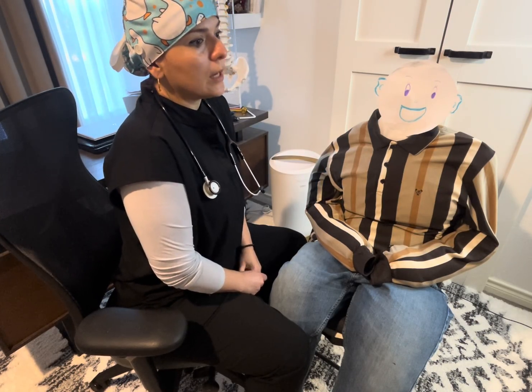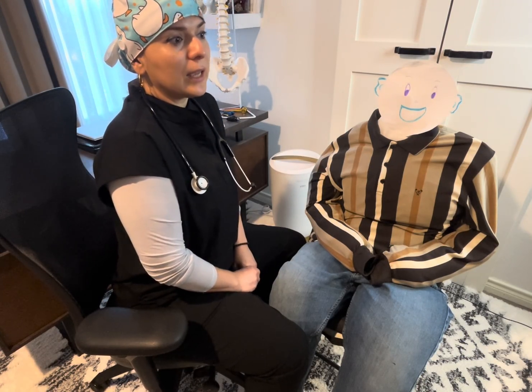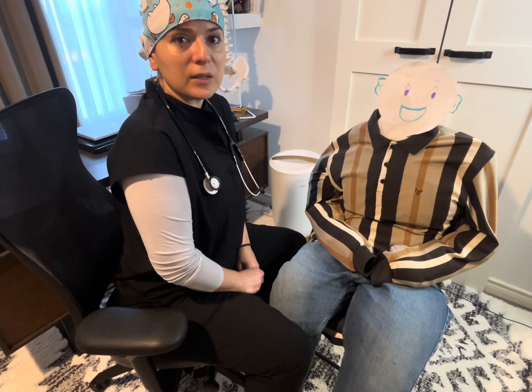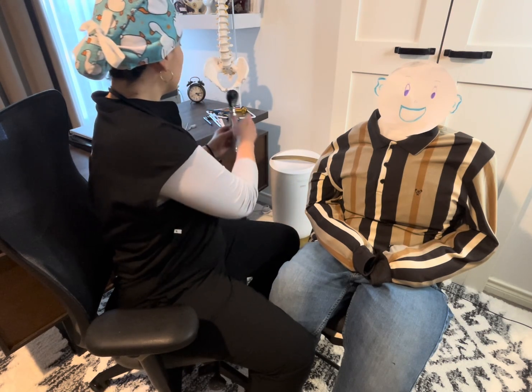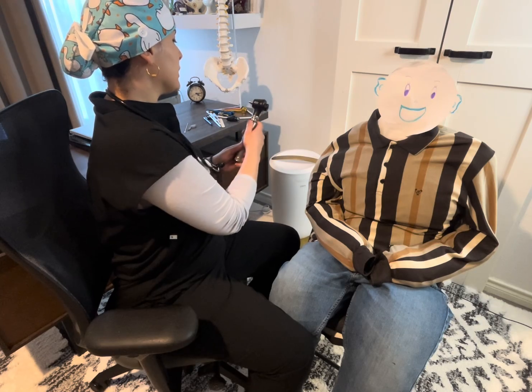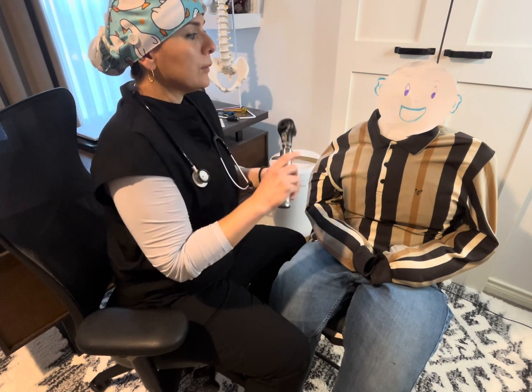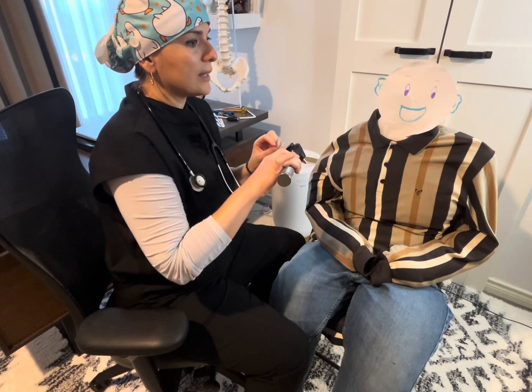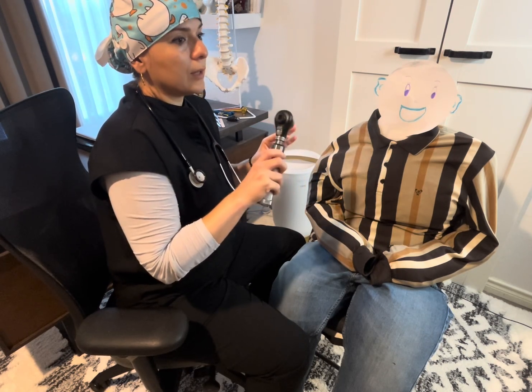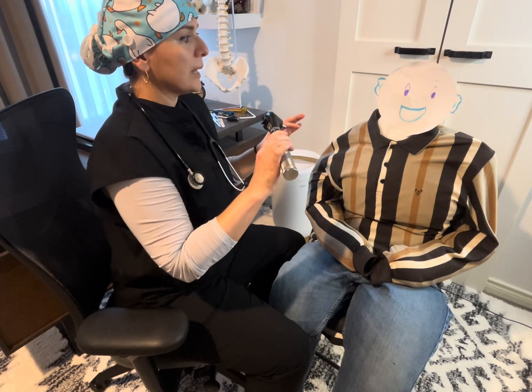After observation we move forward with observing the ear canal, checking to see if there is any blockage. To do that we have a device called an otoscope — I'll show you right here. We make sure it's on, and you hold it like a pen — not like a hammer, like a pen.